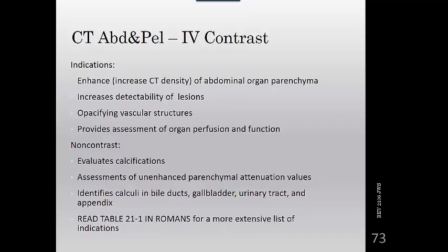The bladder is best appreciated on CT when it's filled with urine or contrast agent. So remember that when you have your inpatients or even ER patients with catheters, you need to make sure you clamp that catheter off before you do your bladder delay, or you're not going to have any contrast there by the time you've waited your 2.5 minutes to scan the bladder, and it's not there if you haven't clamped that catheter.